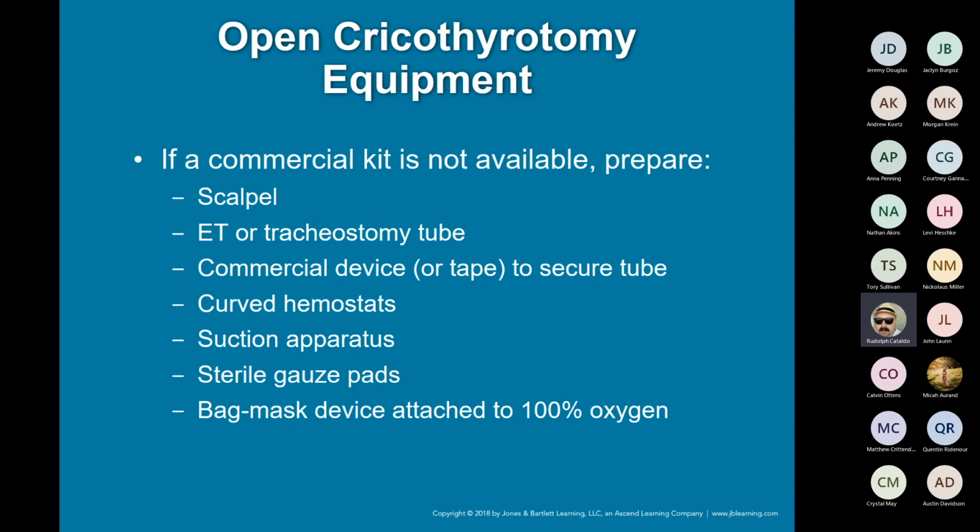Again, you guys will have a chance not to practice surgical crikes, but to practice needle crikes, and then we'll show you as far as surgical what equipment is needed and how that is performed. But usually that's covered in the CCP class in the state of Iowa.